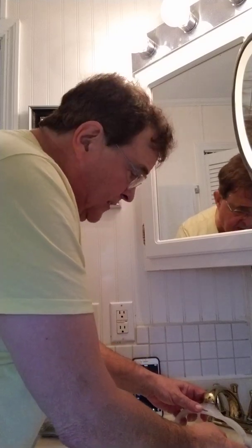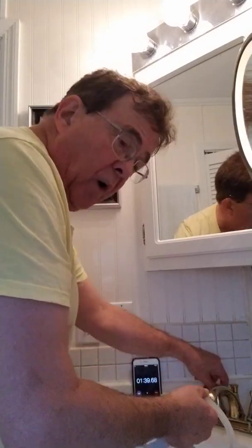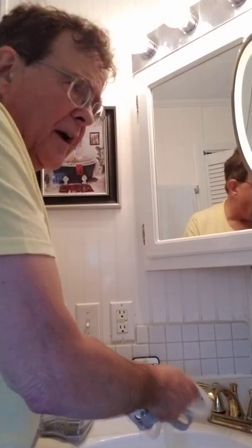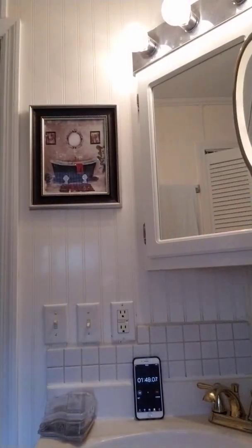As you do that, the dish detergent lifts off any bacteria stuff, and the water just washes it away. And by the way, the water in our houses is monitored at the water treatment plant, and they disinfect the water to kill off bacterial things, so you have an extra action going on in there. In fact, tap water is really safe because they have to adhere to EPA guidelines even stronger than those that produce bottled water. So you can't really lose that.